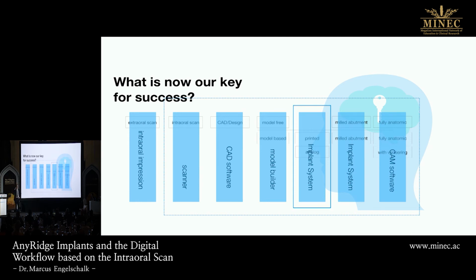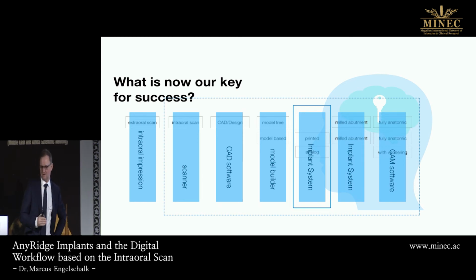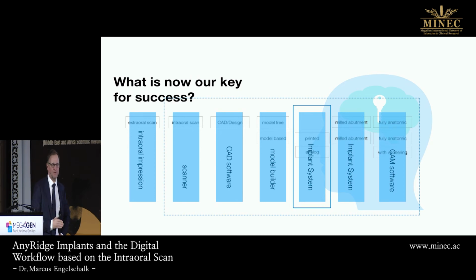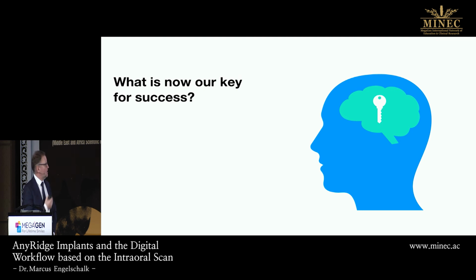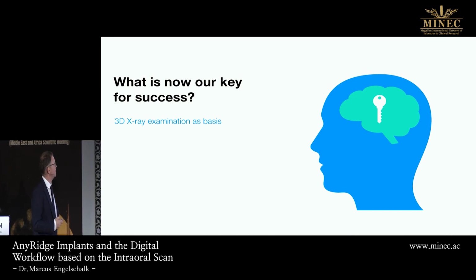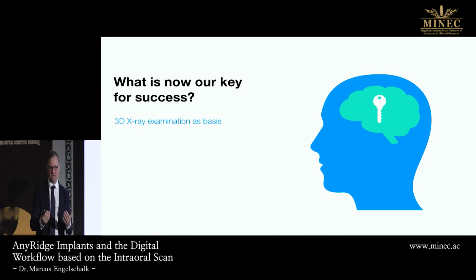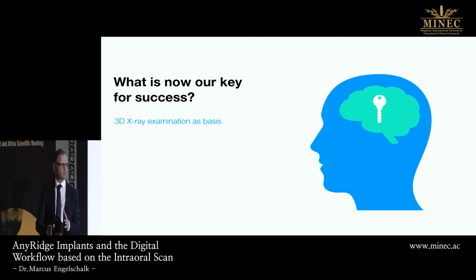So the possibility for digital workflows is always depending on the implant system you're using. Because some implant systems, they have scan bodies, some not. They have lab analogs, they haven't. So this is very important. So what is now our key for success? It's a 3D X-ray examination as a base. You're starting. You're knowing what you're doing.